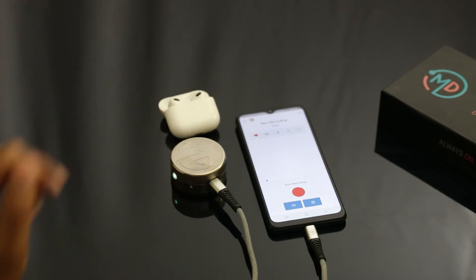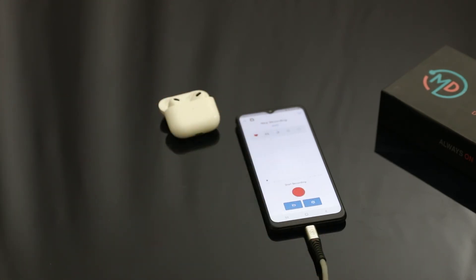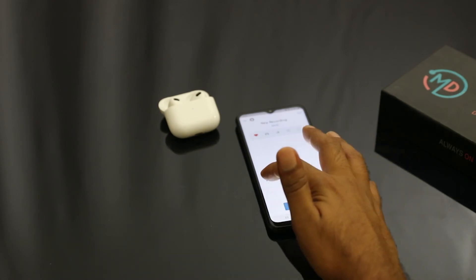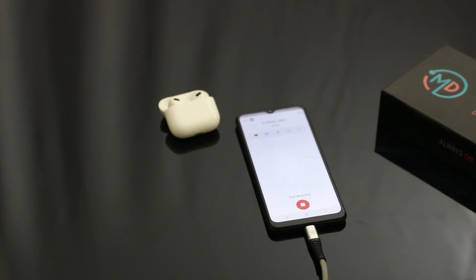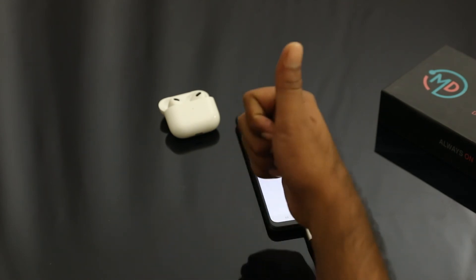Once this is done, take your device and place it on your chest, amplify as required, and hit the record button. Happy auscultation!